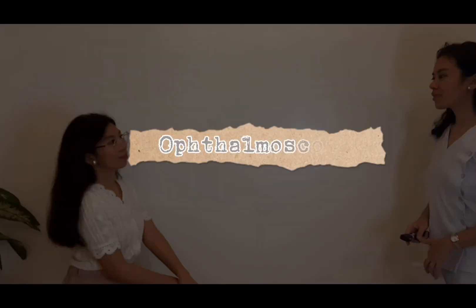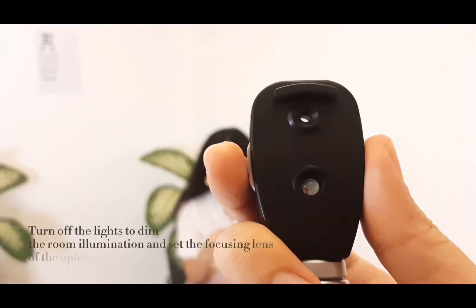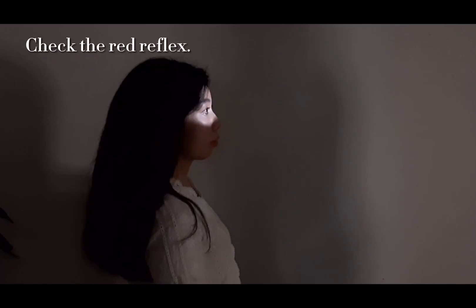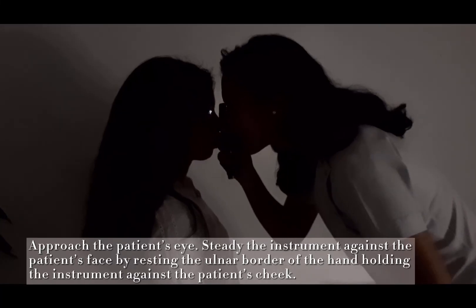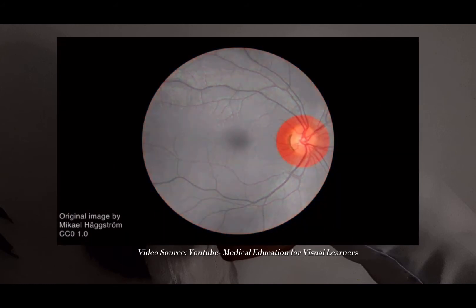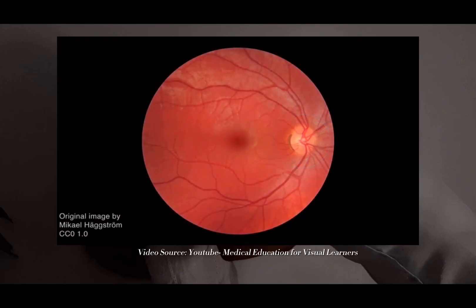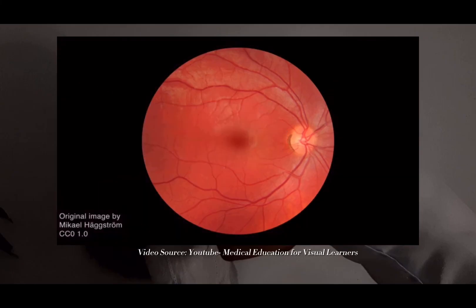The seventh part of the eye exam is ophthalmoscopy. Now we're going to do the panoptic exam. I'm going to test your right eye first. Check the red reflex at a distance of around 2 feet. This is the fundus. In viewing the fundus, we first have to find the optic disc by following the retinal blood vessels. From the optic disc, we follow the blood vessels outward to examine the four quadrants around the posterior pole, and then we check for the foveal reflex.